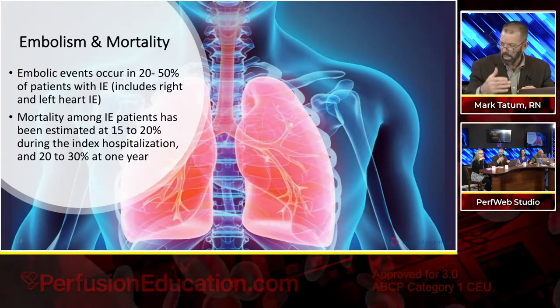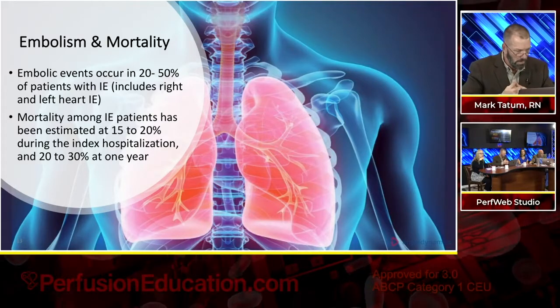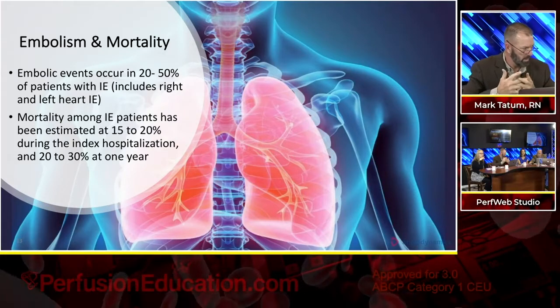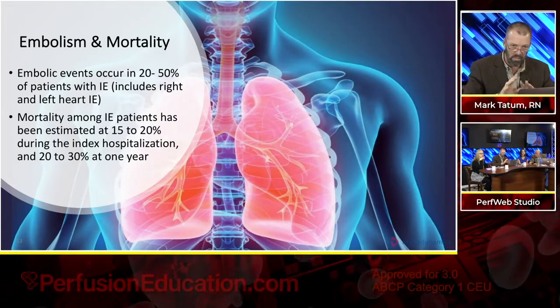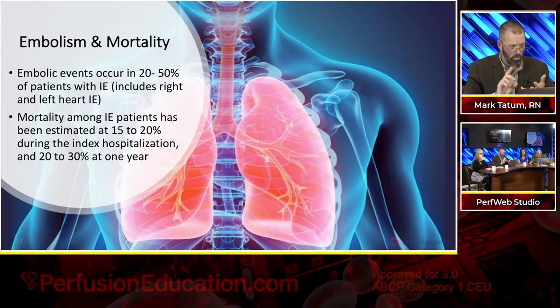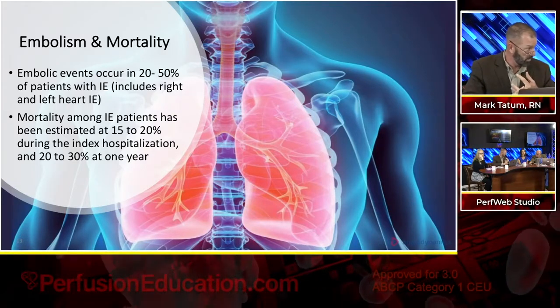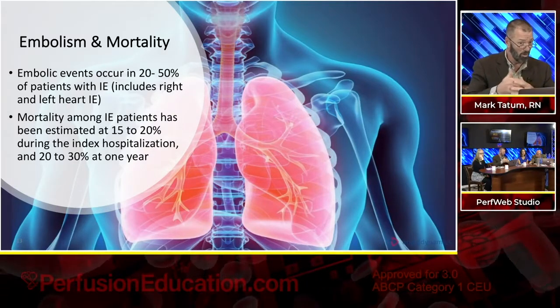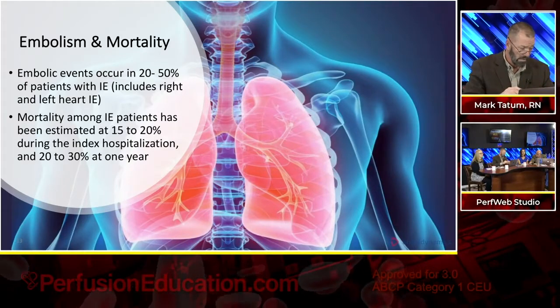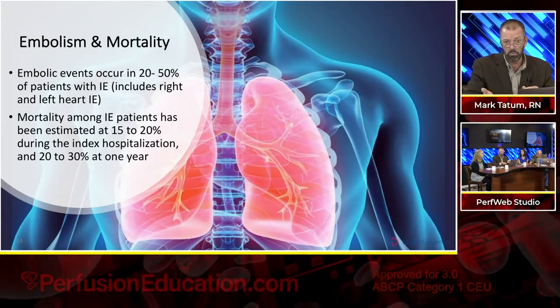Now, we're not saying that if you treat this disease process using AngioVac as an example, that we're going to change the course of treatment as far as antibiotics are concerned. We're not trying to make a claim today that we want you to treat for less time or with a different antibiotic. We still want you to do blood cultures before you get started. We want you to know what organism you think you're treating, get them on antibiotics, and see what we can do to relieve the sepsis. And there are other benchmarks that we look at, not the least of which is the size of the vegetation. HRS 2017 says that 2 centimeters or greater is when we should begin to address this problem.